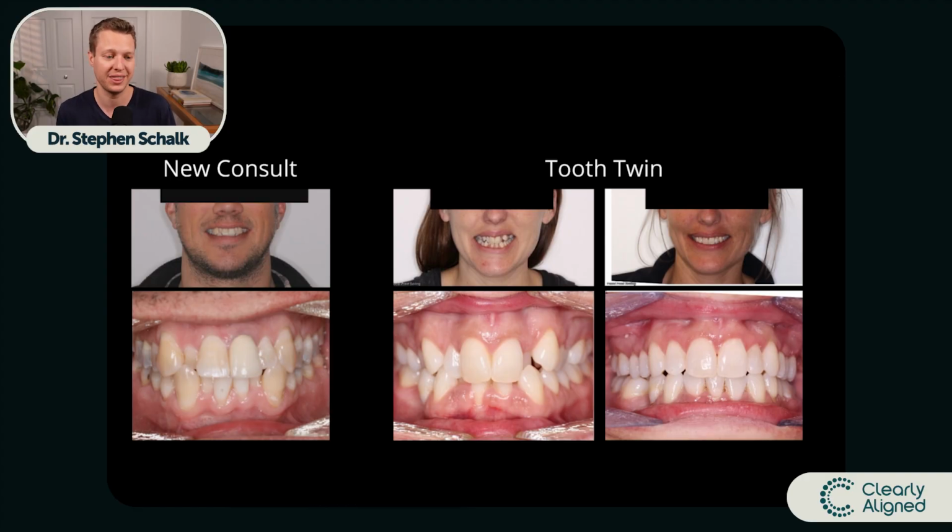They just know a force is being put on them, and that causes the bone around the teeth to resorb in certain areas and deposit in other areas. Because those teeth have no knowledge of what's pushing on them, it's not a question of, can Invisalign fix my teeth? It's, can I fix that patient's teeth with Invisalign? What I like to do in a situation like this is I like to go ahead and show patients a tooth twin library. So I can show him a patient who has almost the exact same situation going on, right?